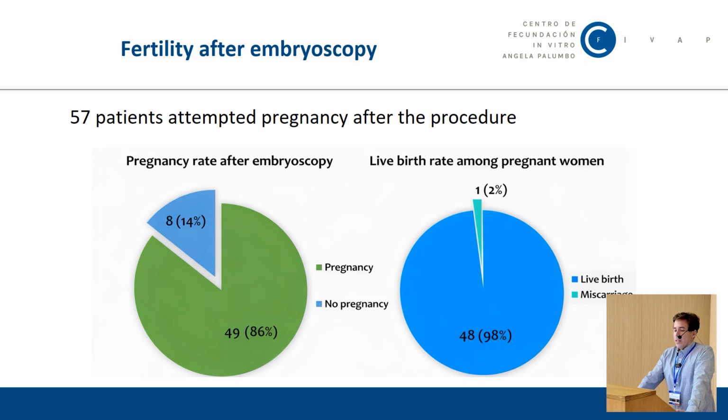And about the fertility after embryoscopy, 57 patients attempted pregnancy after the procedure, and 86% of them got pregnant, and 98% of them had a live birth, only one had a miscarriage.